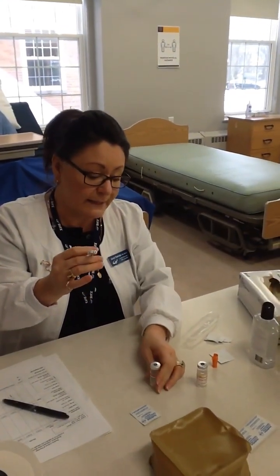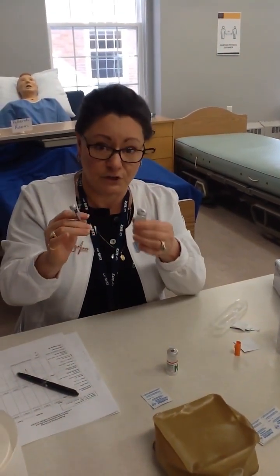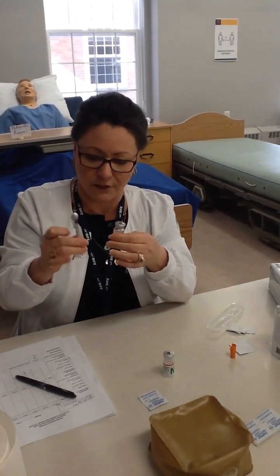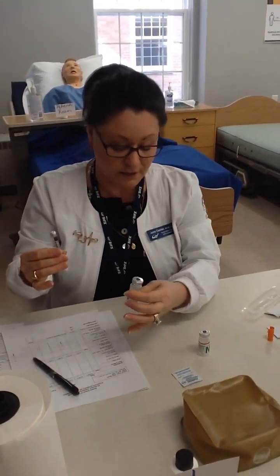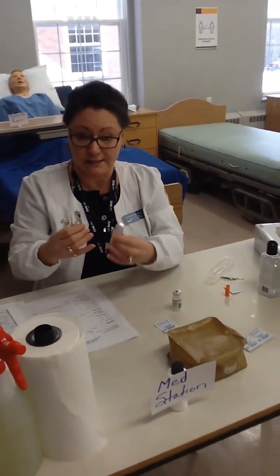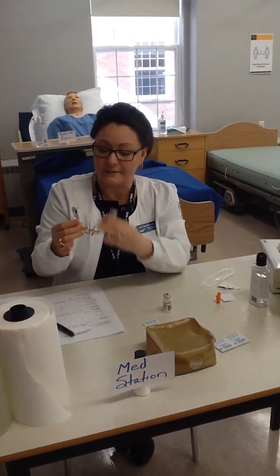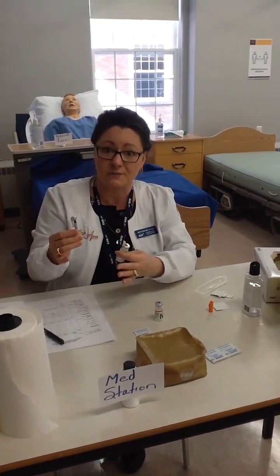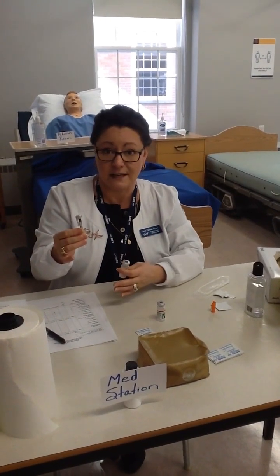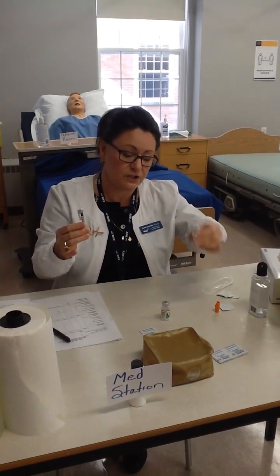So I'm ready to go ahead, and actually while I'm right here, I think I would finish my third check with my insulin R while I have it right here with me before I move on. So I go ahead and start at the top with my right patient. I know I have the right patient. I have the right drug, insulin R. I know I have the right dose now, and a second nurse checked my work. So I have 6 units, that's the right dose, and I've given Jesse the right education. I checked his blood glucose level. I know that he's taking this for the right reason. It's because he's a diabetic, and so that's my third check with that first drug. I'm done with that first drug.